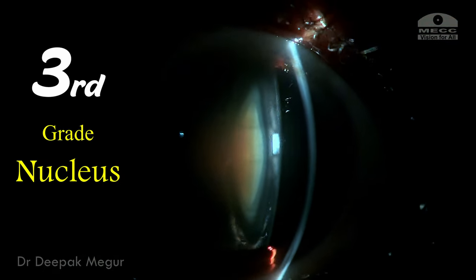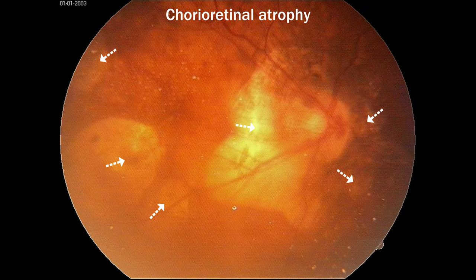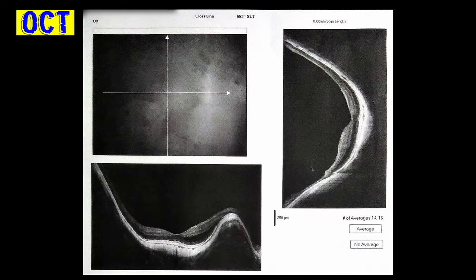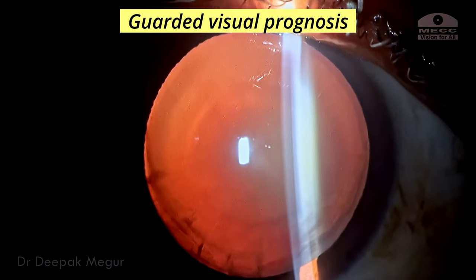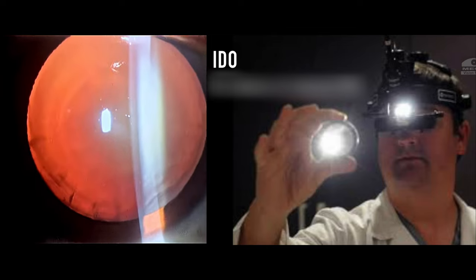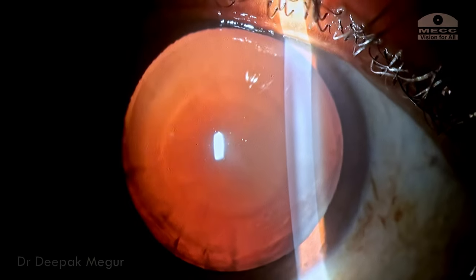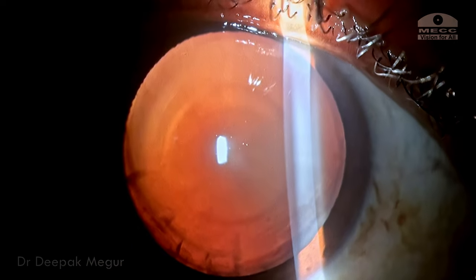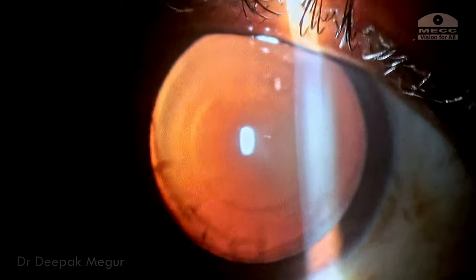She has grade 3 nuclear sclerosis. On dilated fundus examination, these are the fundus pictures. Although we can see areas of chorioretinal atrophy, the foveal area seems to be reasonably all right and the OCT has also been done. We need to give a guarded provisional prognosis, examine the retina for any pre-detachment lesions — thankfully she did not have any — and she needs to be counseled that the risk of retinal detachment is going to be high. She requires periodic and frequent follow-up in the immediate and late post-operative period as well.